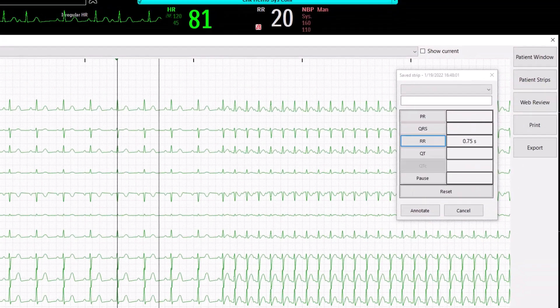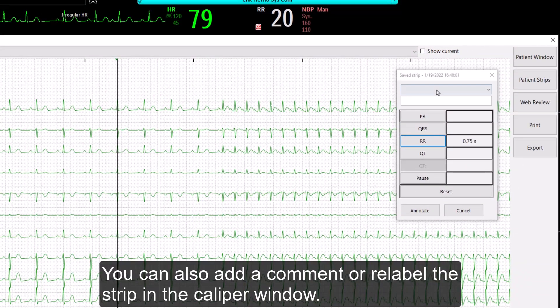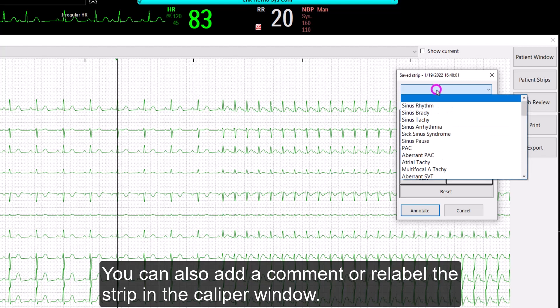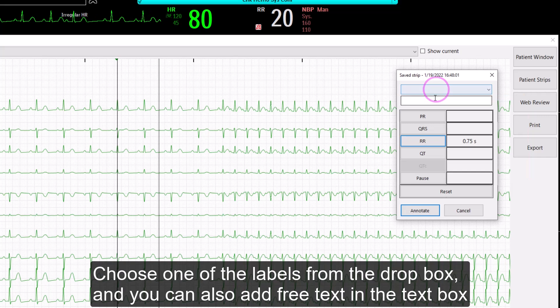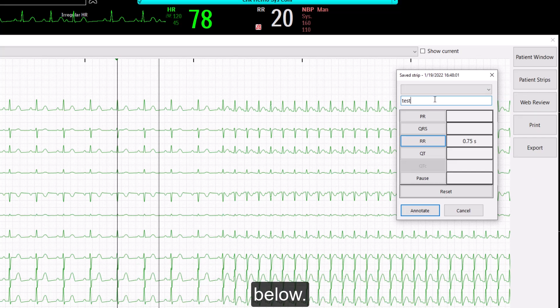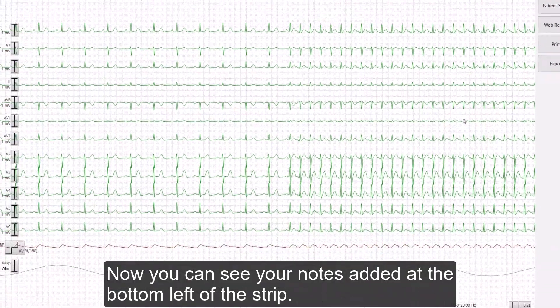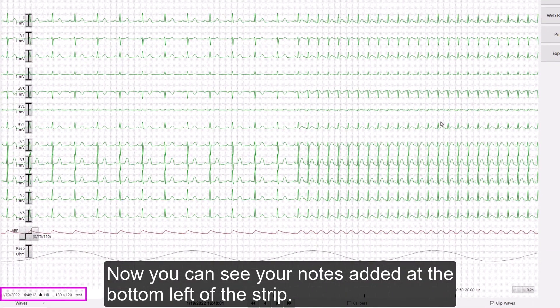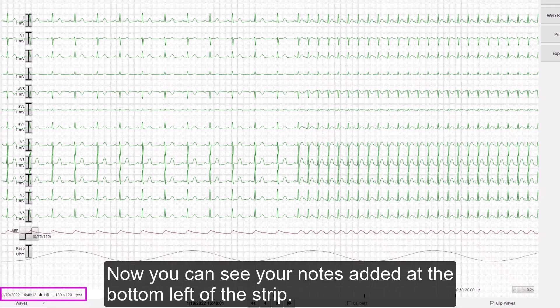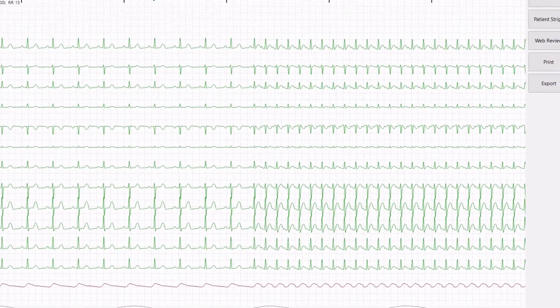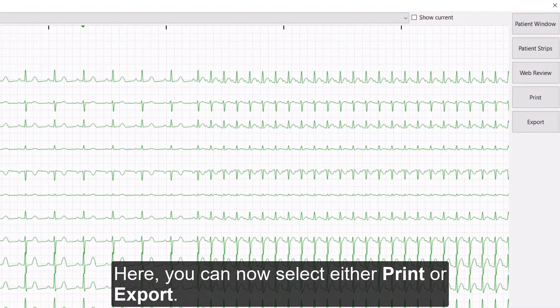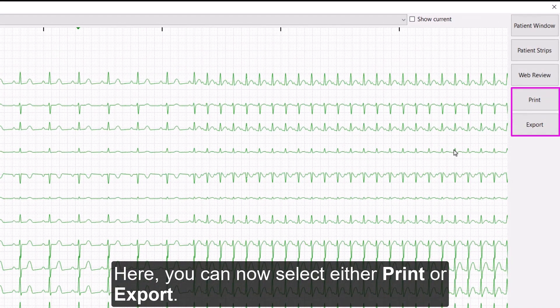You can also add a comment or relabel the strip in the caliper window. Choose one of the labels from the drop-box, and you can also add free text in the text box below. To complete, select Annotate. Now you can see your notes added at the bottom left of the strip. Here, you can now select either Print or Export.